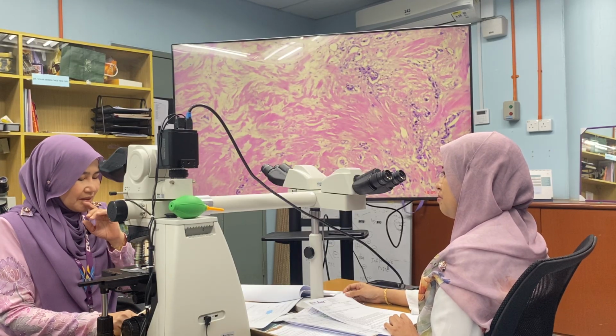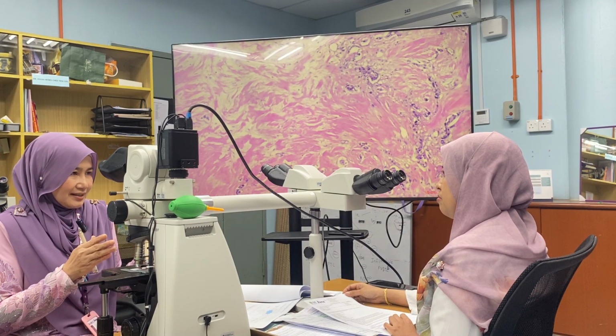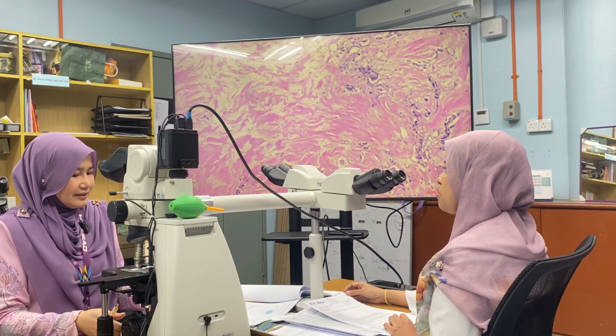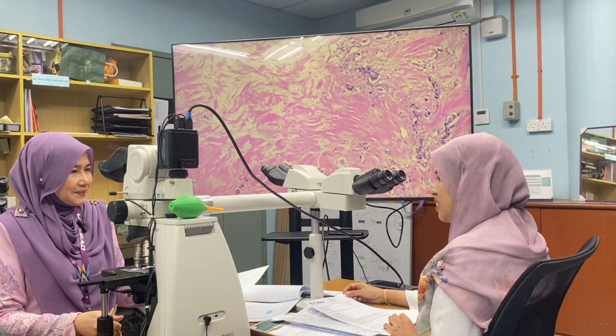Okay, do we need to assess those changes only in the tumor bed, or is there any other area that we need to assess? We need to focus on the tumor bed, but then also the rest of the breast tissue. What about the lymph node? Yes, lymph node also.